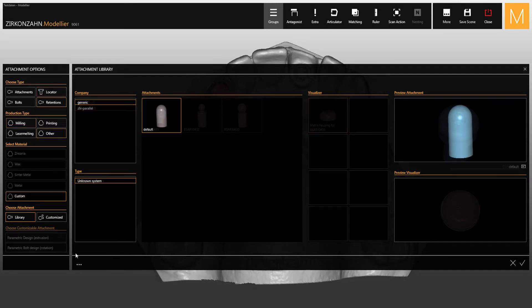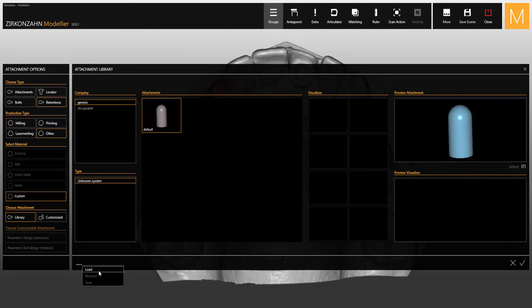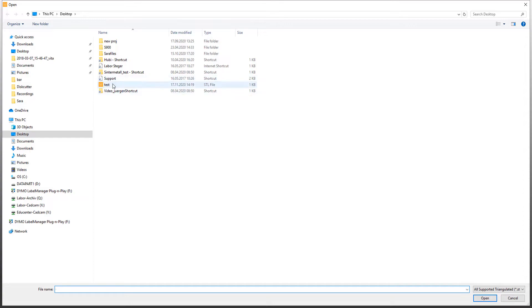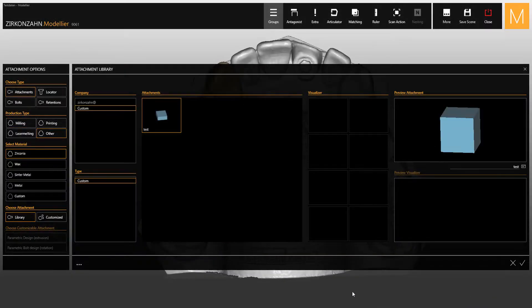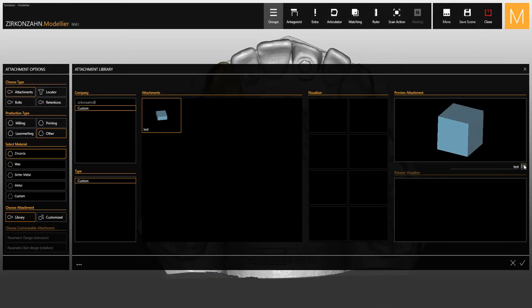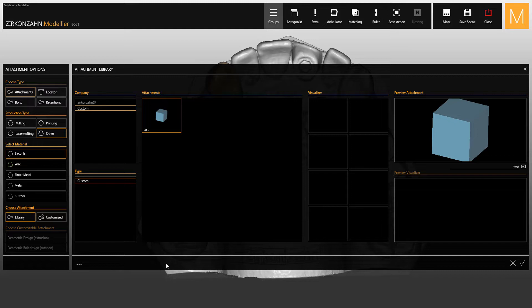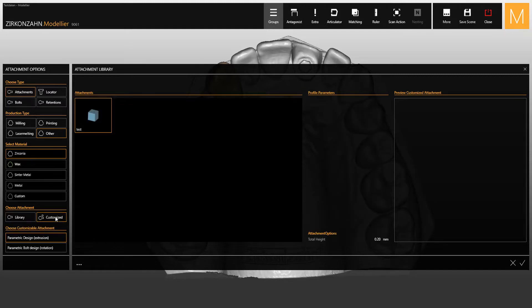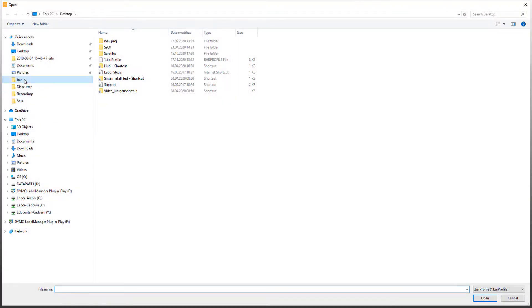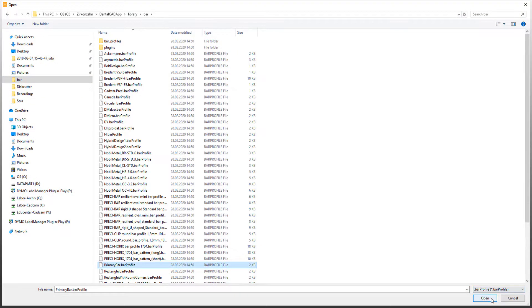By clicking on the three points below, you can import your own files and use them as attachments. Other than the standard library, there is also a customized section where you can find all imported files. Here you can load a bar profile which can then be modified individually.